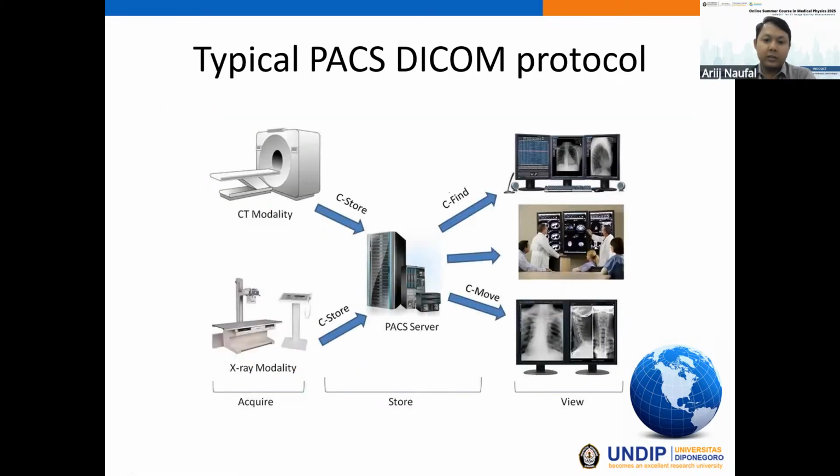Okay, there are several DICOM protocols in a PACS environment. For example, C-STORE is mainly to store images, obviously, to the PACS server. C-FIND is a command to search images based on a filter, for example dates, patient ID, study description, and so on.